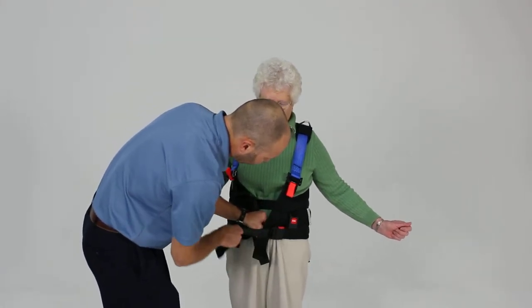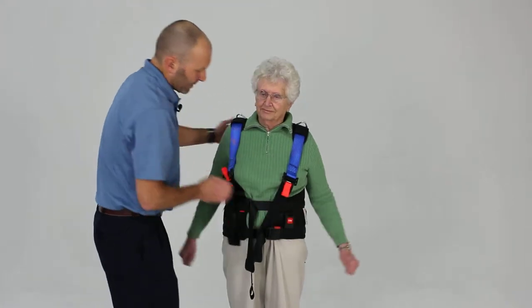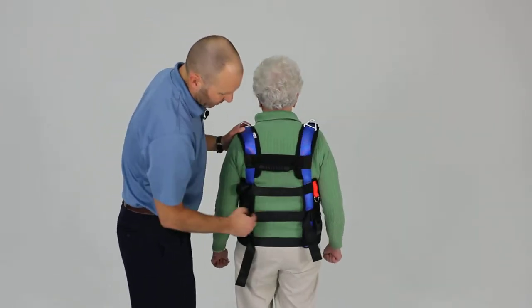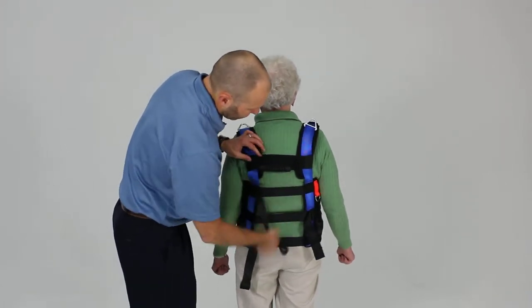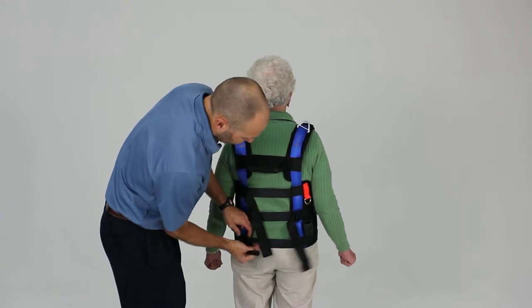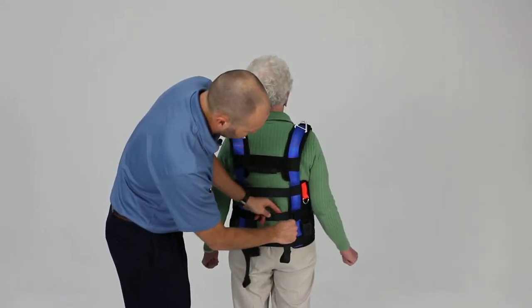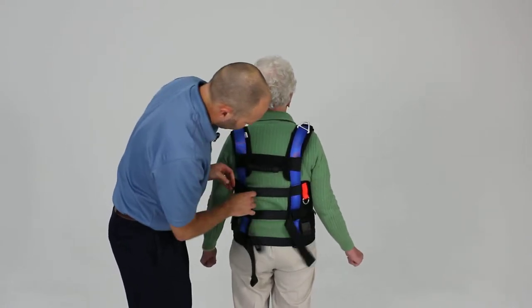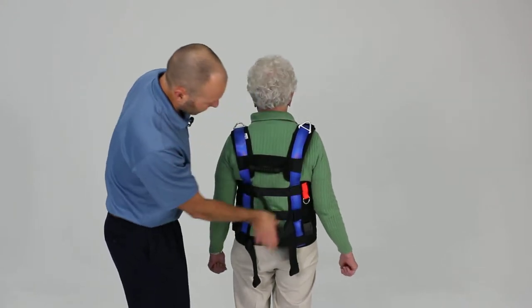I'm going to tighten those up a little further. You'd rather err on those being a little farther forward than too far back. Once we've got that in place, we're going to go ahead and tighten up our back straps. There are three back straps and we're just going to tighten those up. Sometimes it's easier if you just feed a little bit of webbing into the buckle — as you're pulling one with the free end, you're kind of feeding forward with the end that is attached.